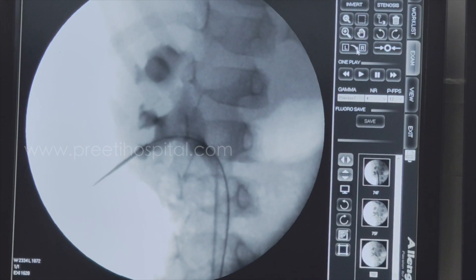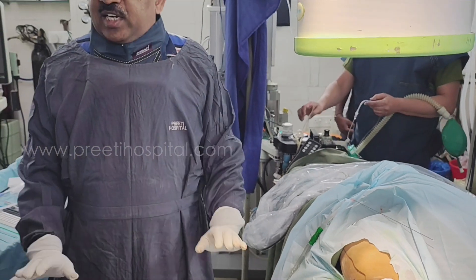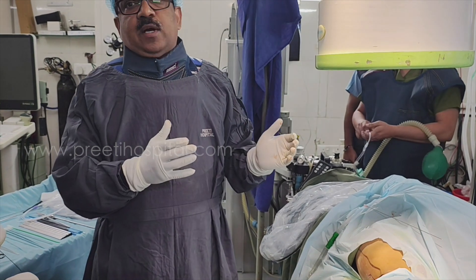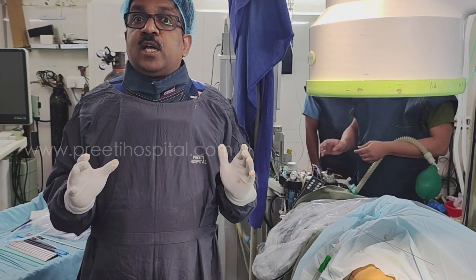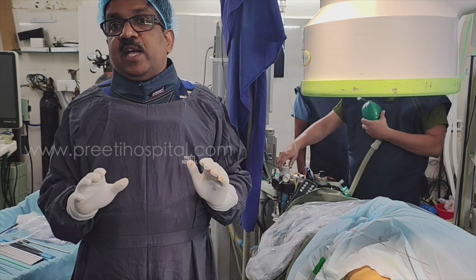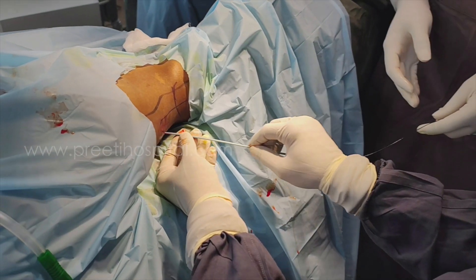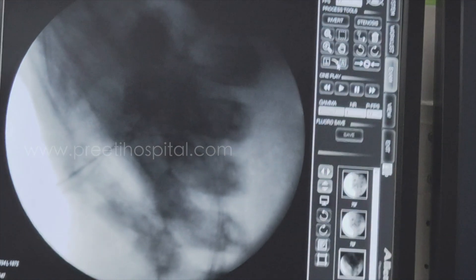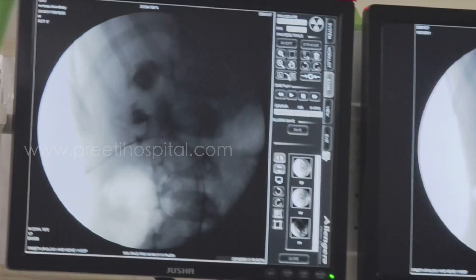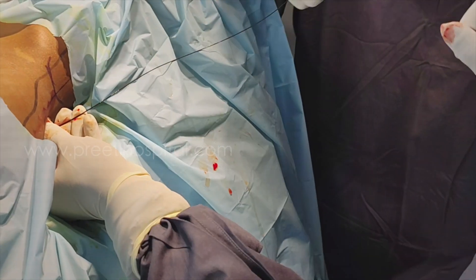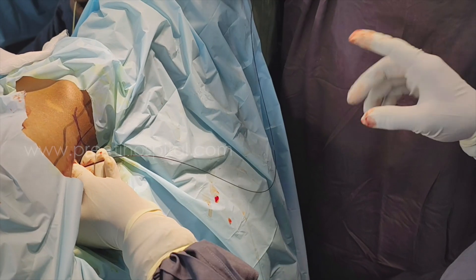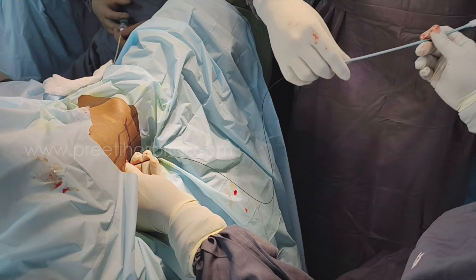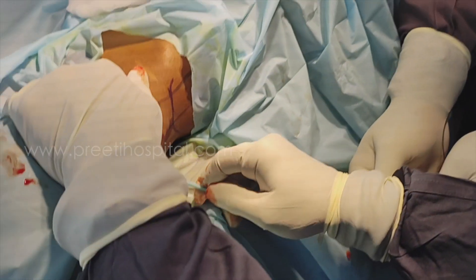Now do slow dilatation. You can do mini PCNL. People like Ramrushna can do it slowly and finish, so that in future such large kidneys have no damage. Show the step by step dilatation. First you rotate and arm the C-arm. This is not a very good dilator — it has too much flex. Don't use such type of dilator in children. It cannot dilate properly. You need a stiff dilator because the rectus sheath flexes and doesn't offer assistance. At the same time, the tissue is highly thick in children because it is healthy.